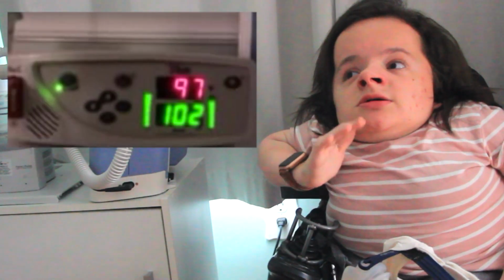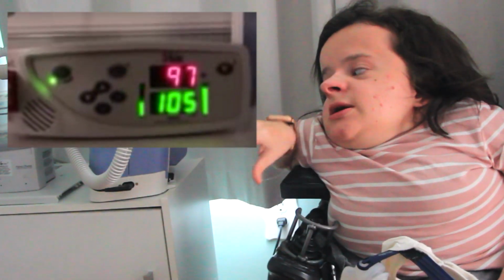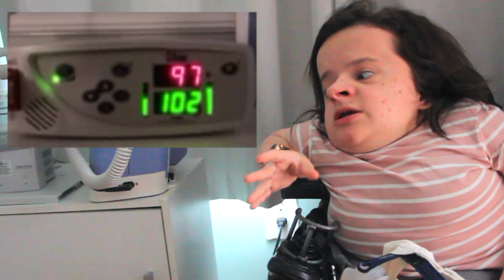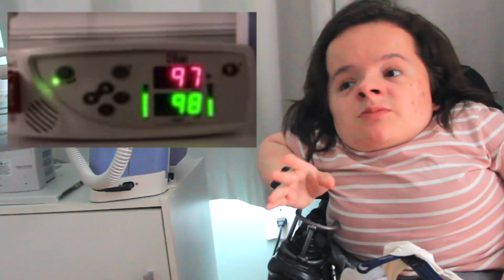I have this, and it's so reliable, and it measures my oxygen level and my heart rate. Anything for me above like 95 is good. We like to see it higher, but if it gets below 94 or lower, we know I'm either getting sick or something isn't right. With my heart rate, I'll insert some footage. I'm not going to turn that on right now because I just don't want to go through all that, but I'll insert some footage I took on my phone last night when I was wearing it in bed. I was getting pretty tired, so my heart rate was going up and down a little bit because I was just on the verge of falling asleep. But then I remembered I wanted to take that footage.